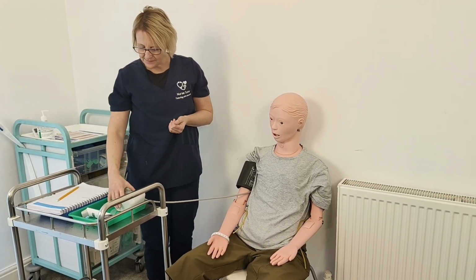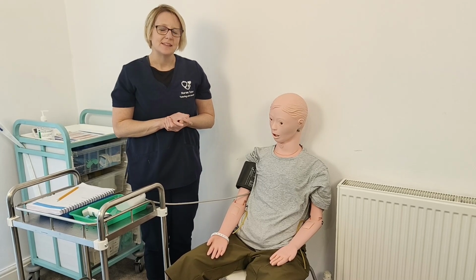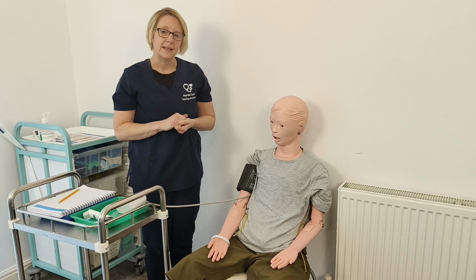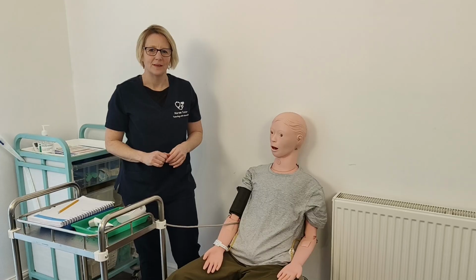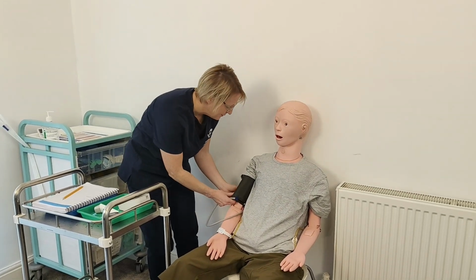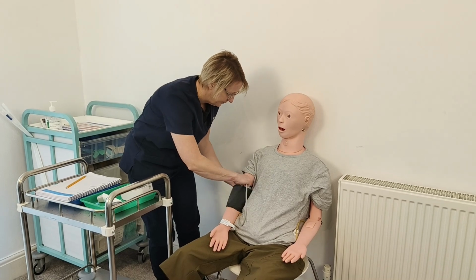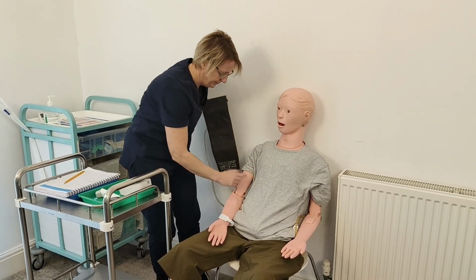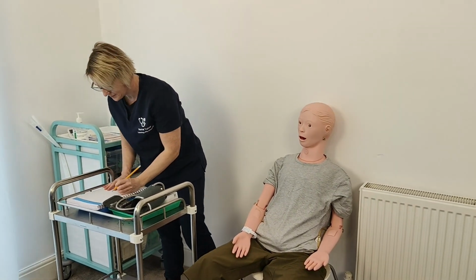So my blood pressure has finished now, and it's 101/60. So this is slightly low, but maybe in keeping with heart failure. So I'm just going to jot this down, and I'll be escalating all these observations. So I'm just going to take the blood pressure cuff off now. So I'm just going to take this off your arm, Rose. Well done, that's all finished. I'm going to put my equipment back. I'm just going to jot down my blood pressure reading now.